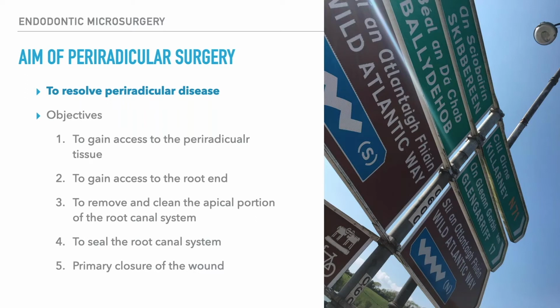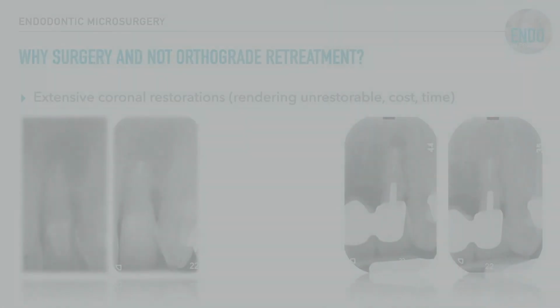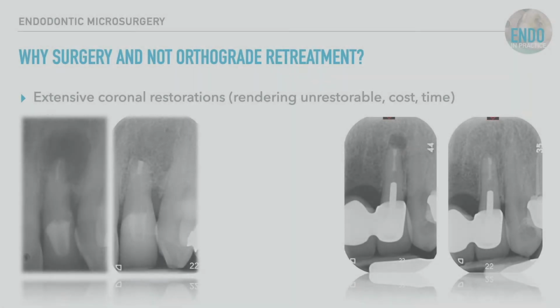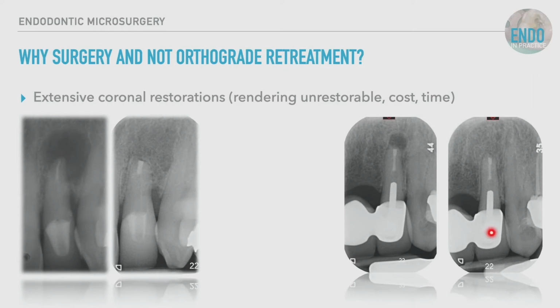And as I mentioned, I would talk about the indications and the contraindications. That big elephant in the room, I will admit it, is a very grey area: what do you do with that heavily restored tooth? That is the biggest grey area in decision making for endodontic surgery. If you see the case on the right-hand side, this was a 3-unit bridge that the patient had spent £3,000 on 6 months ago, but now they ended up with periradicular disease associated with that lateral incisor.